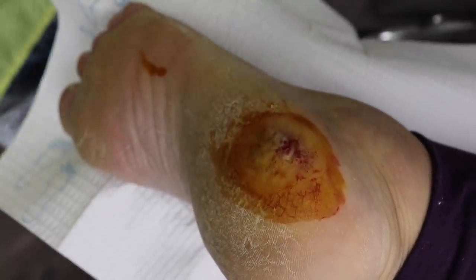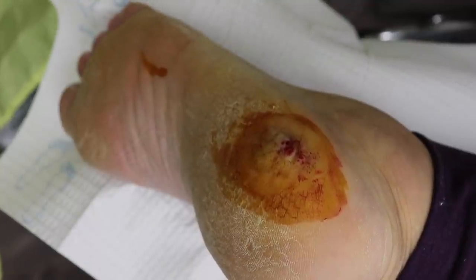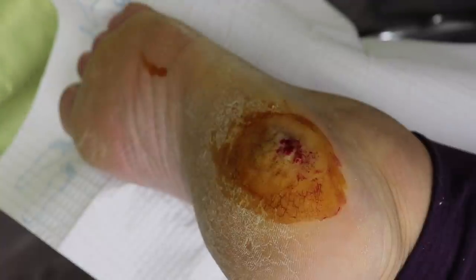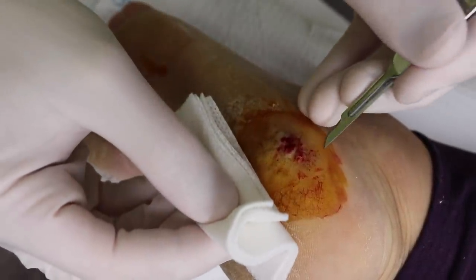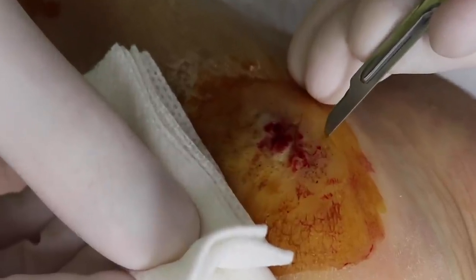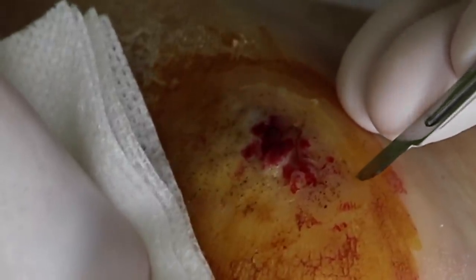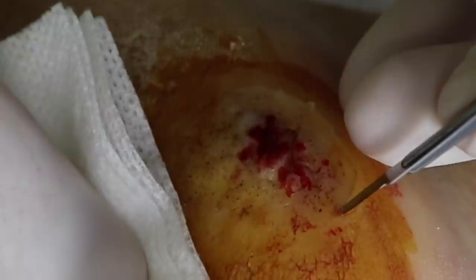So let me put a bandaid on it and rearrange you into a better position. What's very important to know is pressure is completely normal — pain is not. If you feel something that's really uncomfortable, it usually feels like a pin prick. You let me know. The crazy thing is it's literally just scooping ice cream off the surface. We're just going to be lifting that wart right out of that top layer of skin.